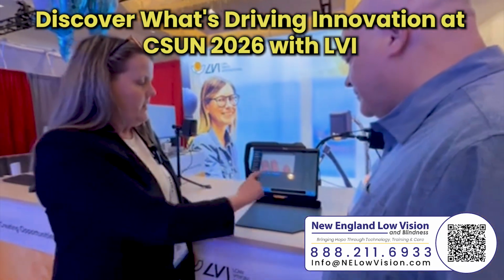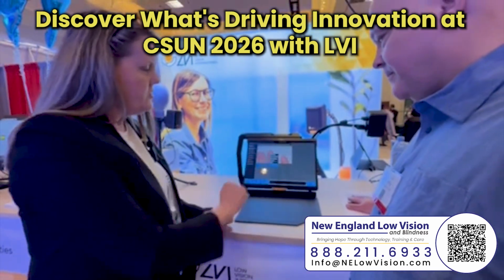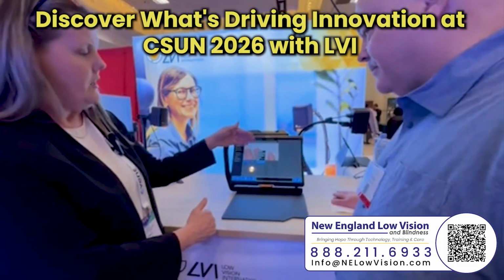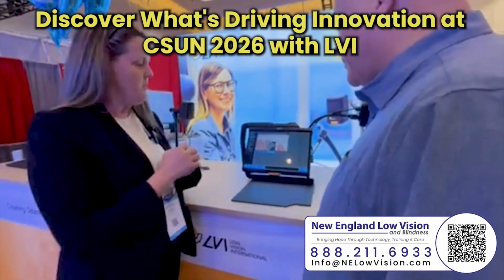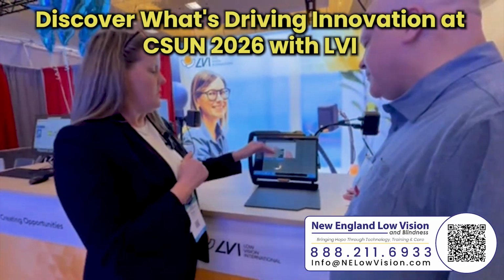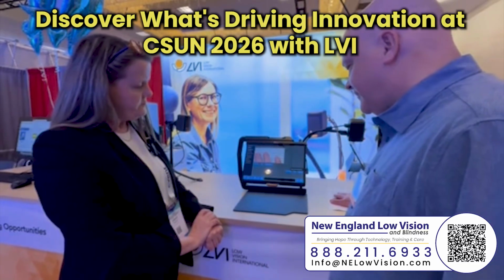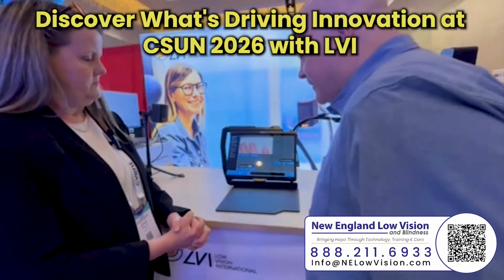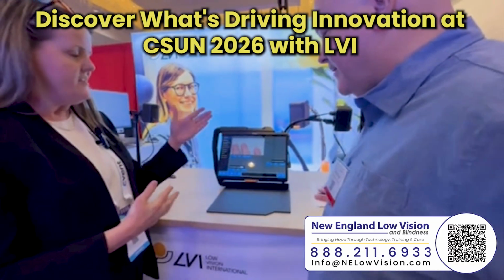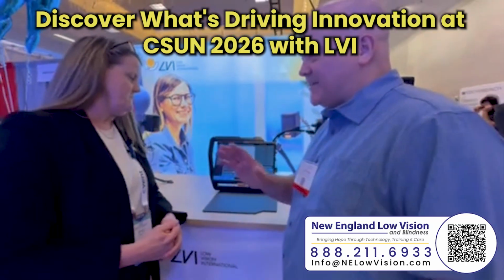Here we have image functions, and we've chosen five functions that are popular for people with vision loss, so we can have it describe short. It'll also do handwriting, which is pretty amazing. Invoice and OCR. So let's see what it says with describe short. What it said was text on paper, fingers present.